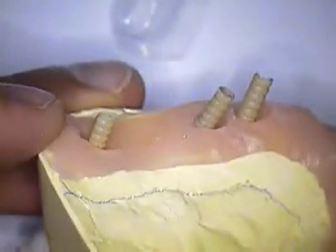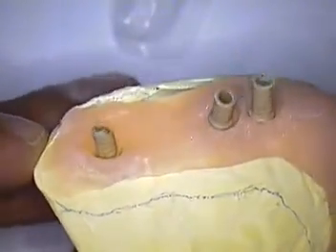So these are the abutments. They were trimmed down and now ready to accept a material.